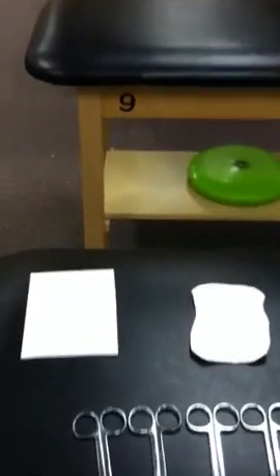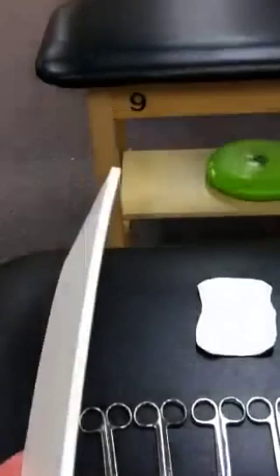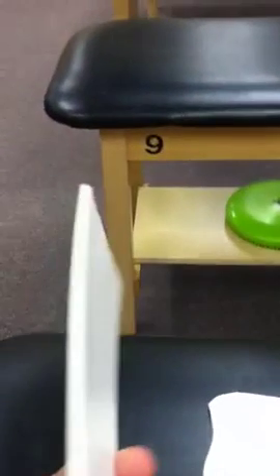Okay, today you're going to make an orthoplast splint. You're going to grab a piece of splinting material. This is called orthoplast splinting material. It's found in many settings in healthcare to make splints for fractures and injured joints. As you can see, it's hard and not pliable at this moment.